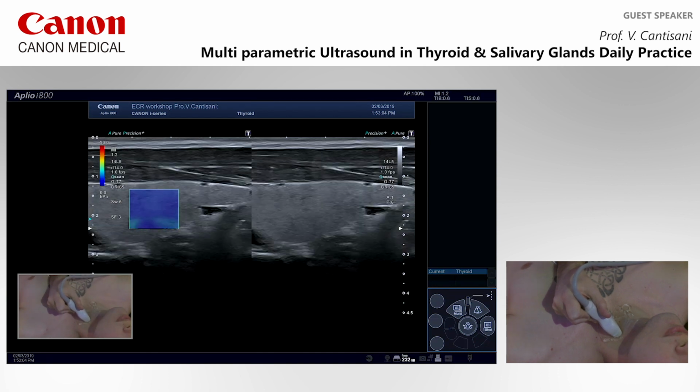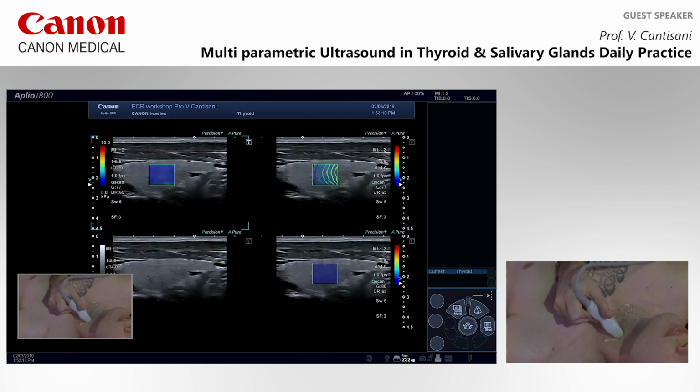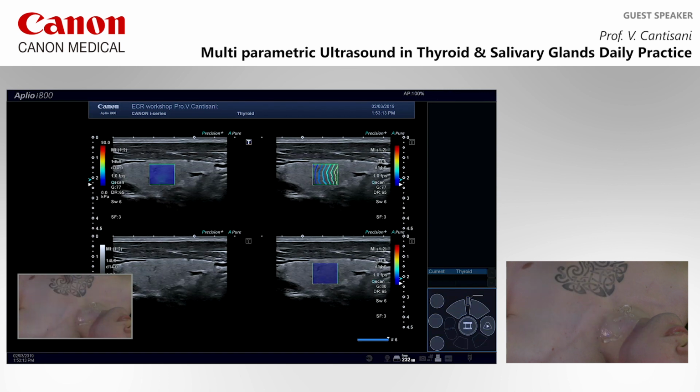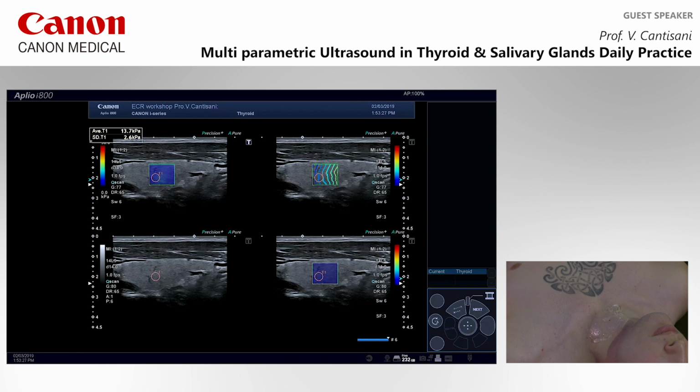Can we show the four representation? Quad view. You have the quad view. Now, what can this machine allow you to do? You have the representation of B mode and any other. Now, you can put the ROI where? Where I told you. Avoiding the vessel, avoiding the artifacts, where the lines are more parallel. So, for instance, here, look at the number, expressed in kilopascal and expressed in meters per second. There is no consensus about it. In general, we start with the kilopascal. Now we are moving to meters per second. We will see. Still, we need to work on it.